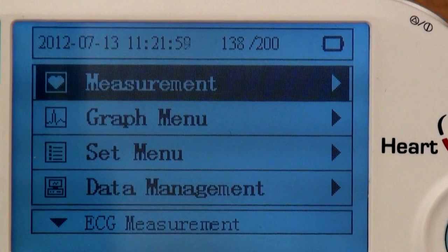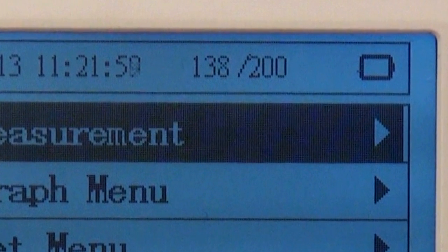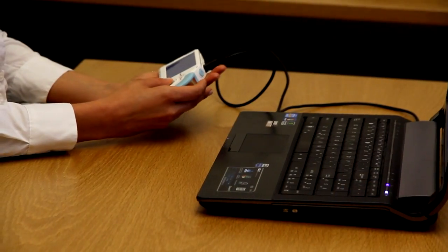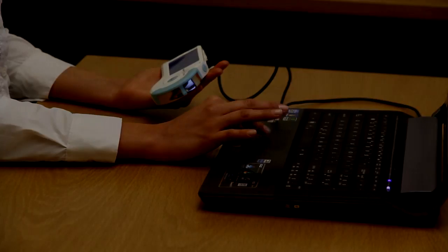Uploading ECGs. Each HeartCheck ECG device can hold a maximum of 200 ECG readings. During a screening program, you should stop using the device once you've reached 180 readings. The number of readings stored on the device is indicated at the top right corner of the monitor. Once the monitor displays 180 of 200, submit the device to your on-site supervisor. Your on-site supervisor will upload the ECGs stored on the device to the HeartCheck website so that the device can be cleared and continue to be used during the screening program.